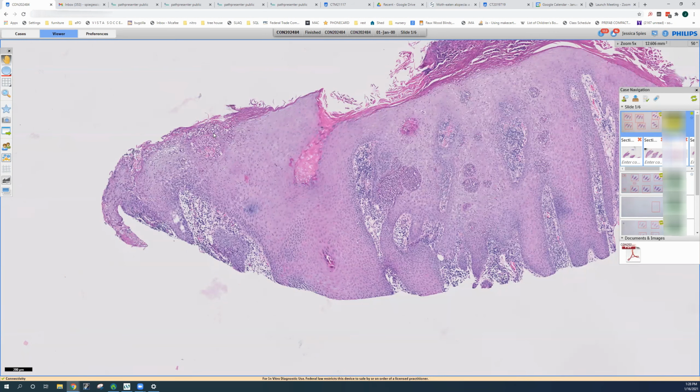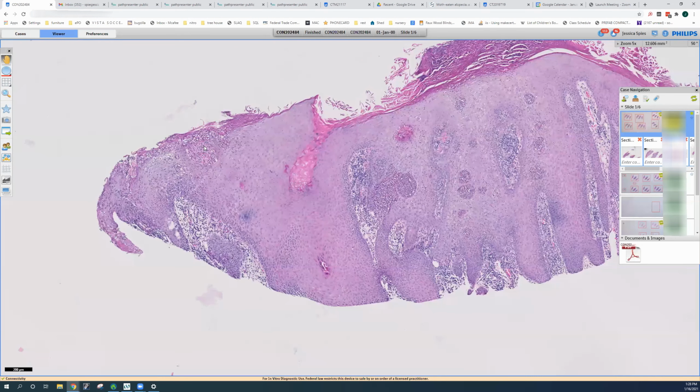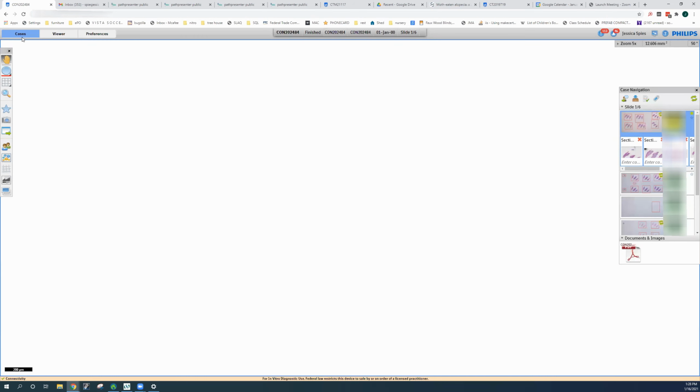And then another thing to think about is a fungal or yeast infection, which can perfectly mimic psoriasis with all these neutrophils. But in a yeast or fungal infection, you wouldn't usually get this kind of epidermal hyperplasia as in condyloma lata. All right, let's go to the next case.